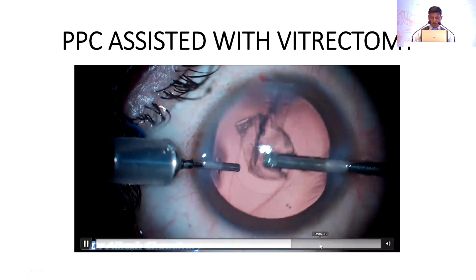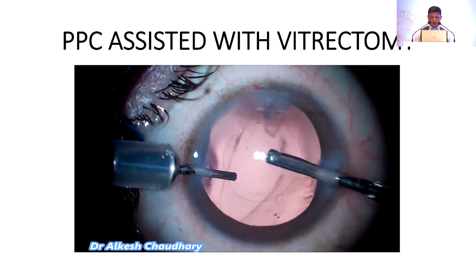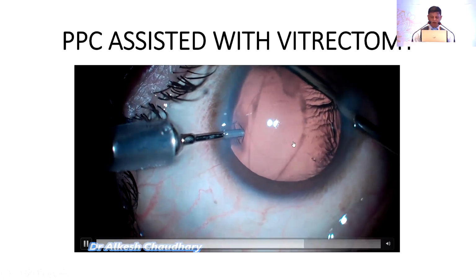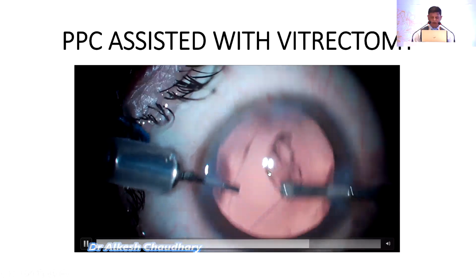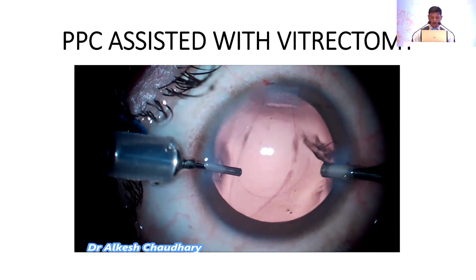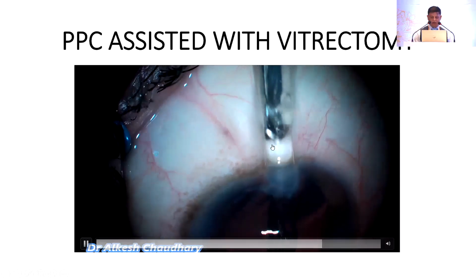So once all of the things are removed, as well as doing the vitrectomy and removing the whole of the cortex, you can now see a large posterior capsule defect. Before coming out again, we inject viscoelastic and take out this small piece. So now this is 100% cleaning of the things.